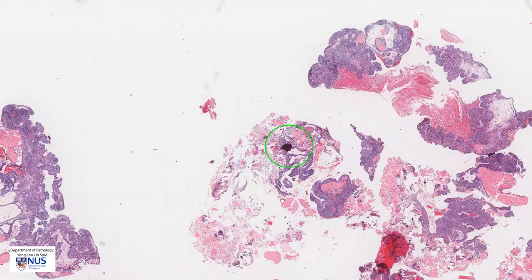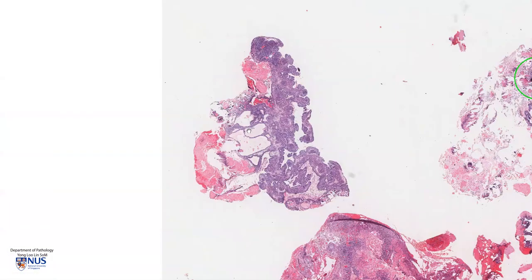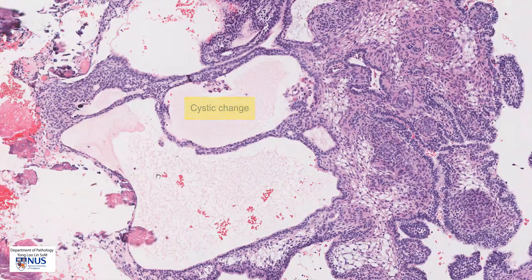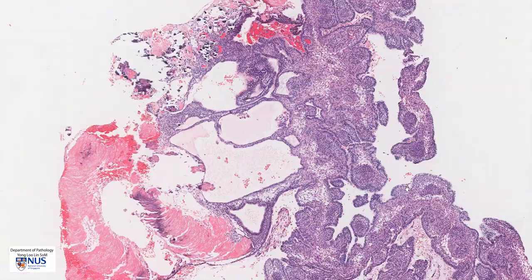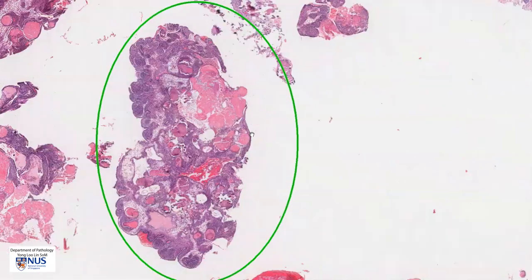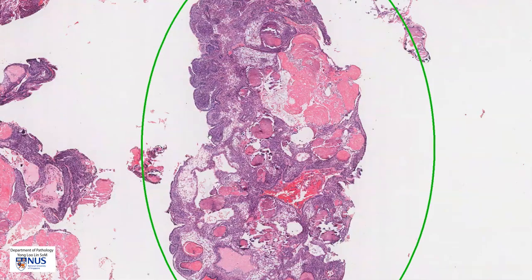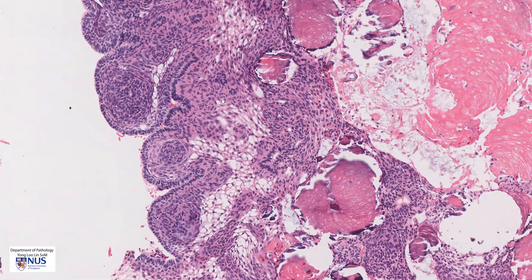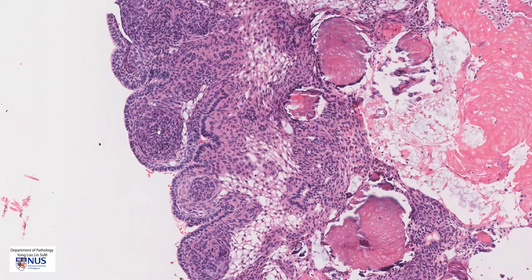Additionally, sometimes we also see cystic change. Over here, there is a small area where there are some small intact cystic areas containing proteinaceous material. In summary, we have multiple tissue fragments composed of large sheets of squamous epithelium with peripheral nuclear palisading, with cellular whirls, and with central stellate reticulum.